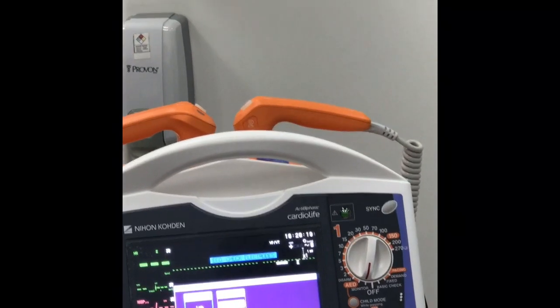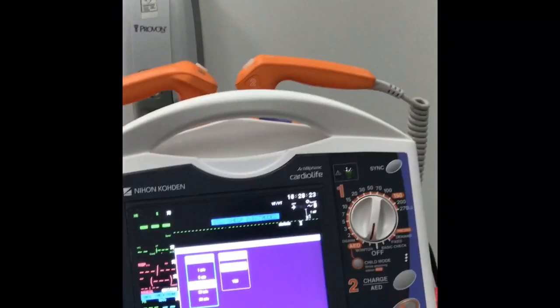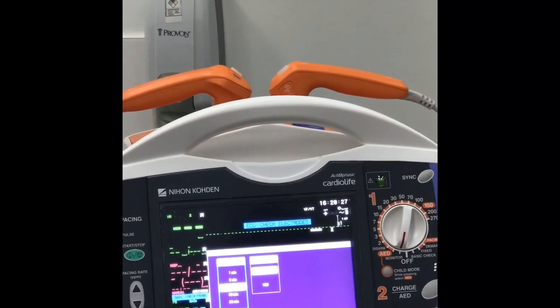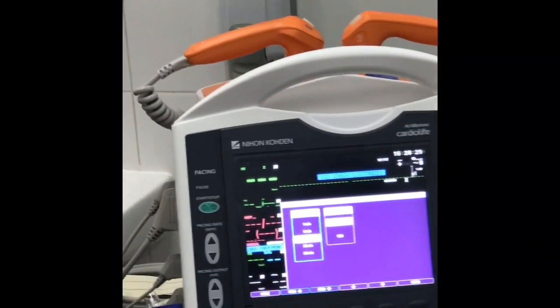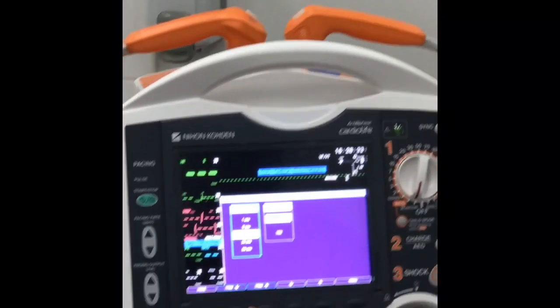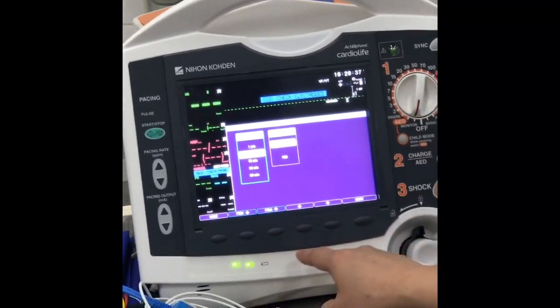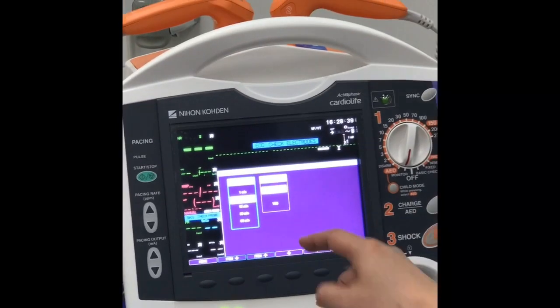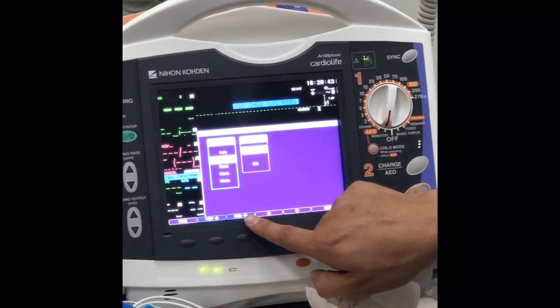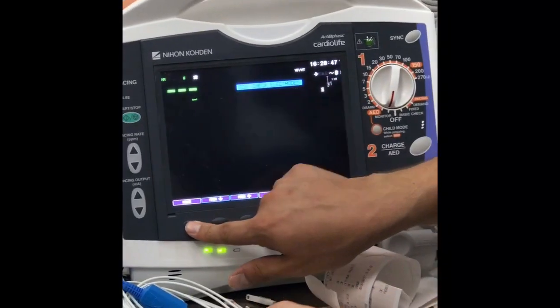Then how to confirm the value? Delete all reports? No. Then you go back to menu, home. It is confirmed. The BP will be taken every 5 minutes. It will give the report of BP, pulse rate, saturation, everything, every 5 minutes. Yes, correct.